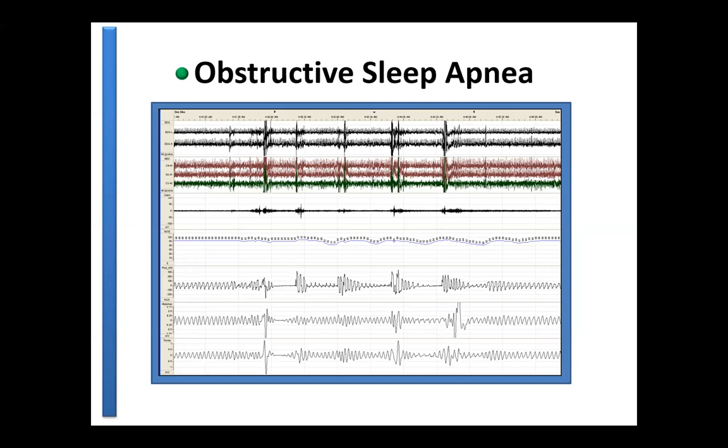And then it looks like you have a couple hypopneas. So you have some severely decreased flow, followed by some oxygen desaturations. And then the third and fourth events, you have these kind of odd ones, just slowly decreasing, maybe an obstructive event. So it's decreasing flow gradually to almost cessation of flow. And this fourth event, similarly, gradually decreasing flow to zero towards the end of the event. So it looks like some mixed apneas and some hypopneas, some of which lead to pretty profound desaturation and some less deep oxygen desaturation. Yeah, it's not too bad because that line starts at 95, so it goes down to 90. Okay. So that's not too much.